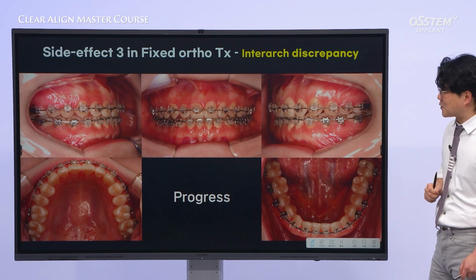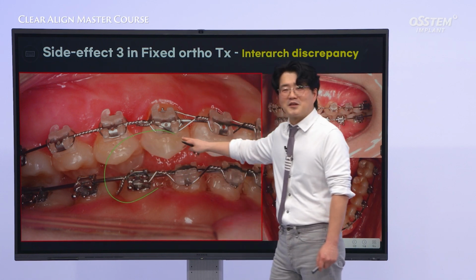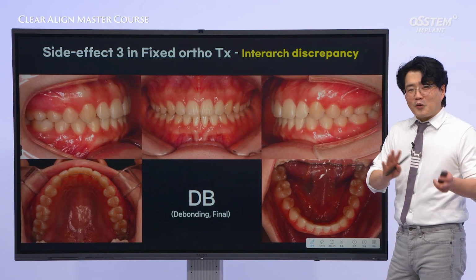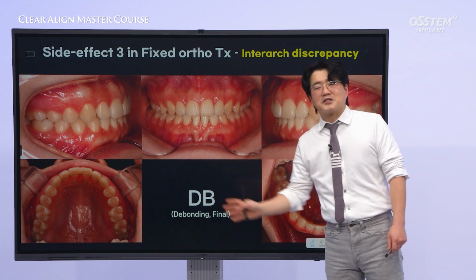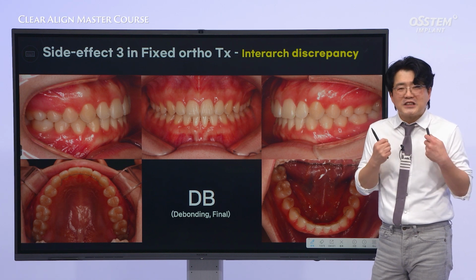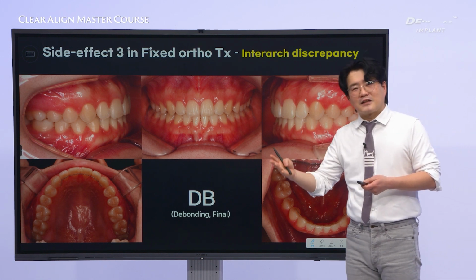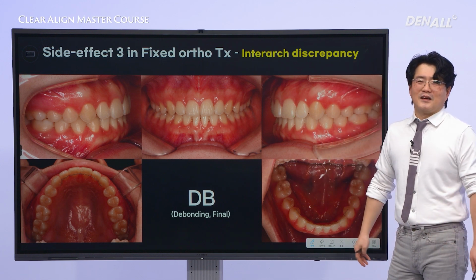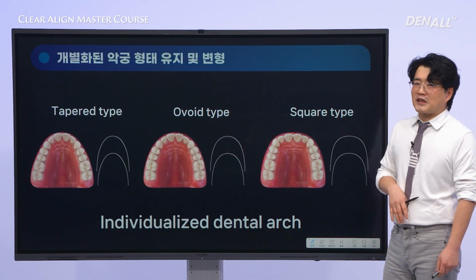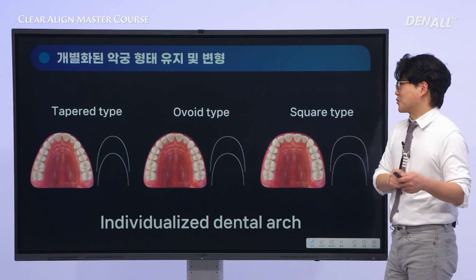Let's take another look. If we look at it closely, we see that overjet occurred on this side as well. What should we do about it? That's a big deal. But anyway, after going through all the difficulties, we got a good occlusal. If you have any unintended tooth movement like an overjet, you're going to have some kind of wasteful element that you're going to have to spend more time and mechanics on, like a round trip again. In that sense, it's not like clear aligners are always better, but they can offer certain advantages in some situations.